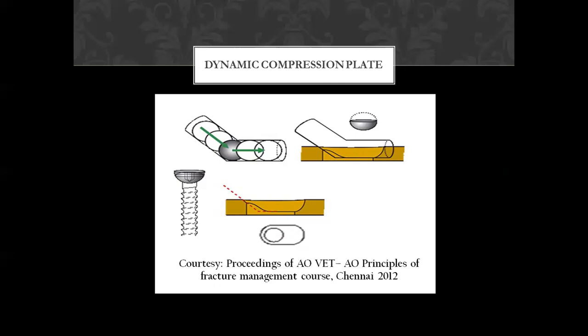Remember the three terms: it's a type of rigid fixation, it comes under compression. Compression, the name itself states that it's going to compress the fracture fragments, and by compressing, it is going to reduce the fracture fragments. Remember, spherical gliding principle.